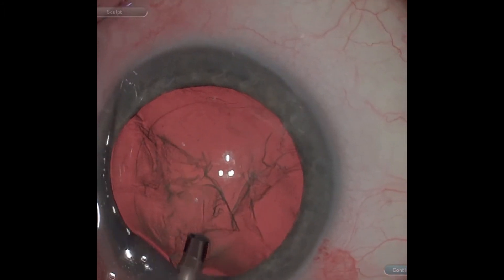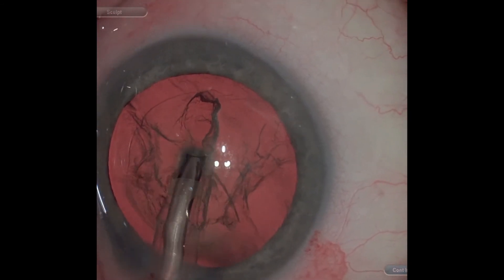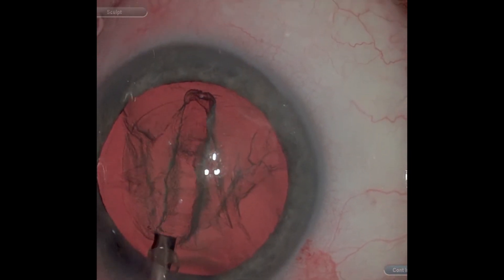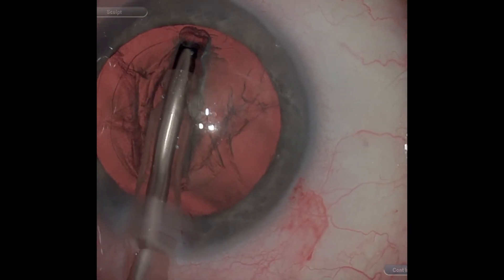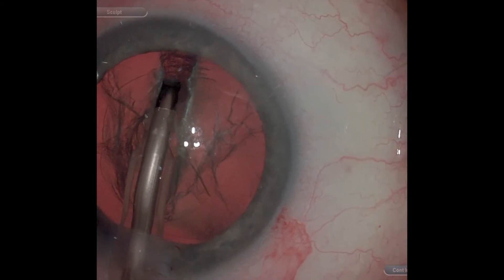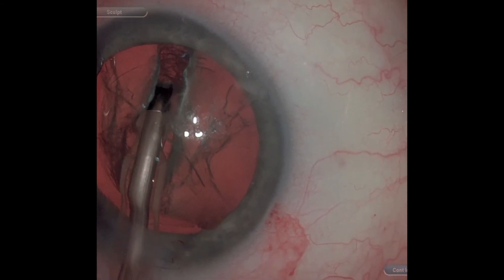Let's look at a few cases to put all these steps into action. You'll see that I have located the proximal edge of my capsulotomy, and I'm using the phaco needle tip to sculpt deep in this proximal third area—angling deep—and by debulking that area, it allows me to flatten into the middle area in a safer way as I create the groove. Also notice I'm becoming more superficial in the distal third.